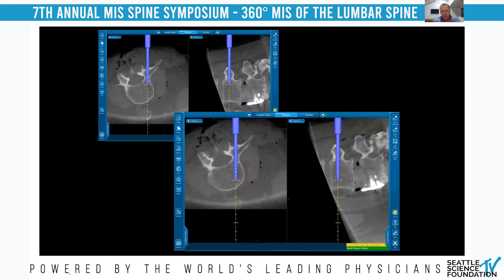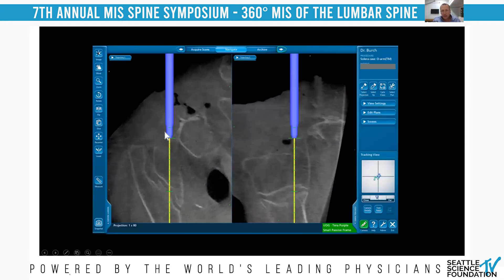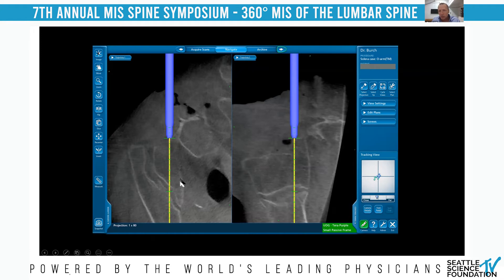Here are some screenshots — the classic drilling and tapping, with cross-sectional and sagittal views, which are great for placing screws whether open or MIS. For SAI screws, you can navigate a projection and save it. That saved projection stays on the image as a virtual K-wire or guide wire, so you don't need a physical guide wire. You can take the tool out and navigate another tool back onto that trajectory to place a screw.